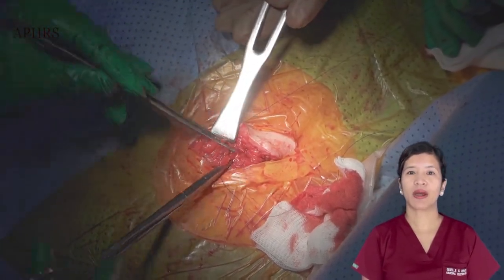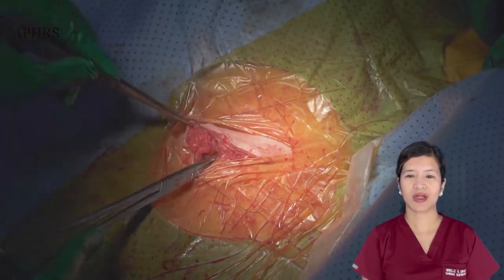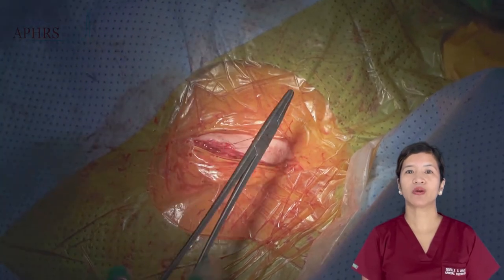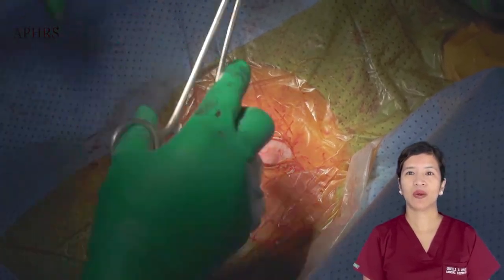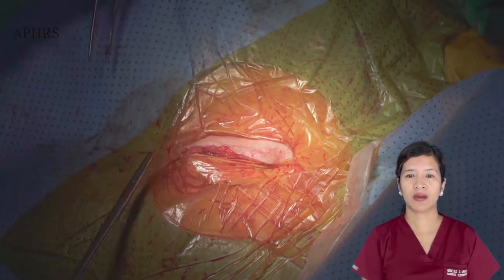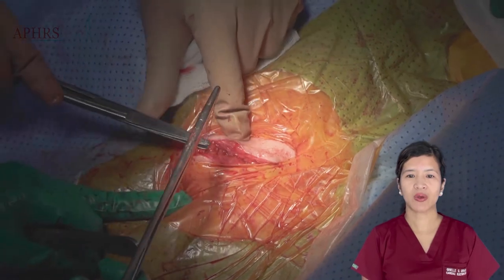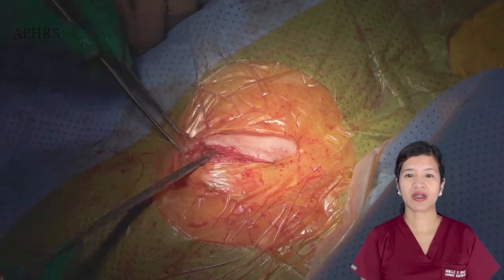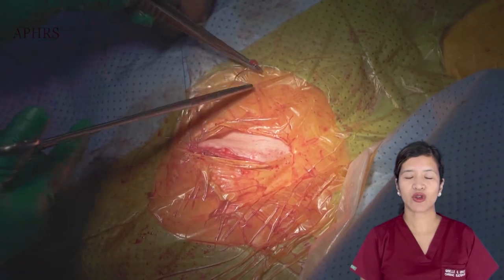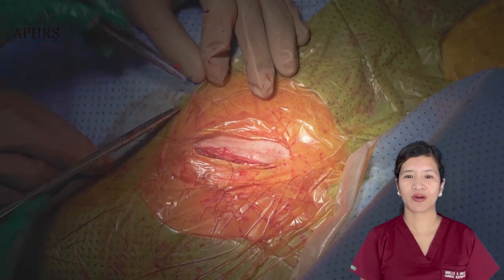If one is not able to capture the pectoralis fascia layer, this inadvertently results in too thin tissue superficial to the generator and eventually thinning out of the tissue and possible erosion, particularly in thin and cachectic individuals. The vertical mattress is a running stitch that involves the lower half to two-thirds of the pocket and the pectoralis fascia.